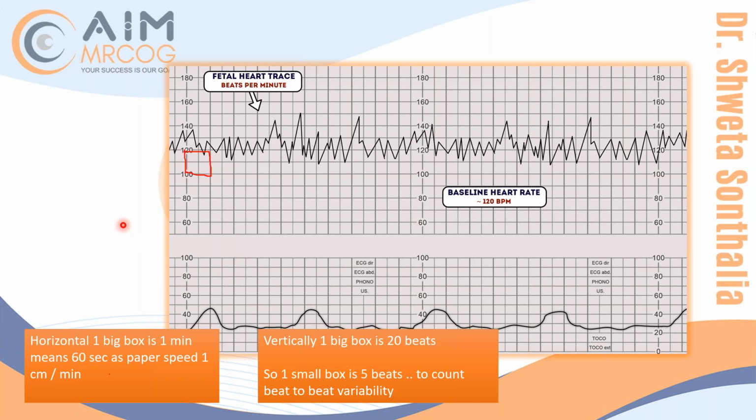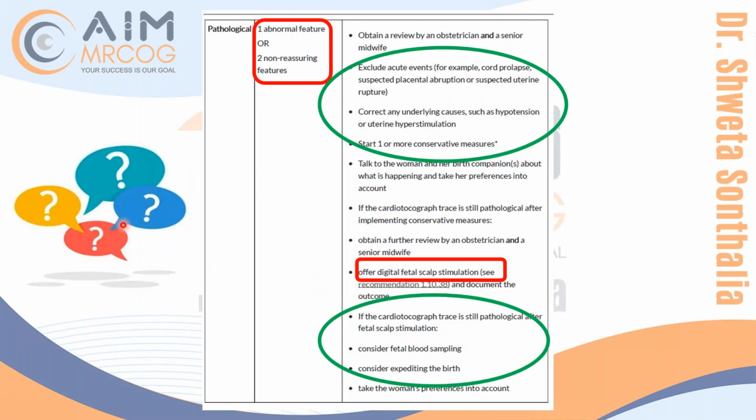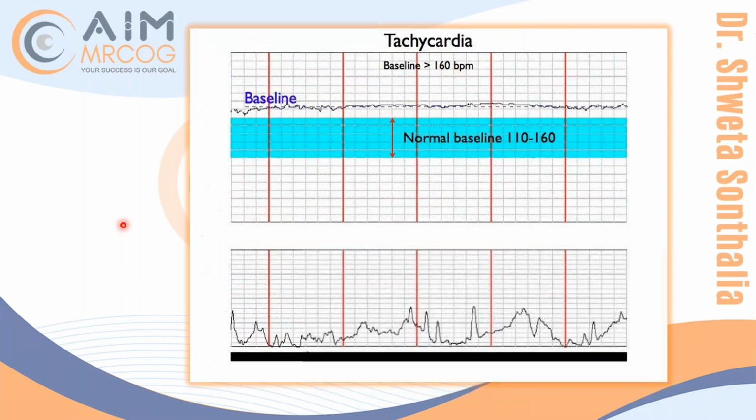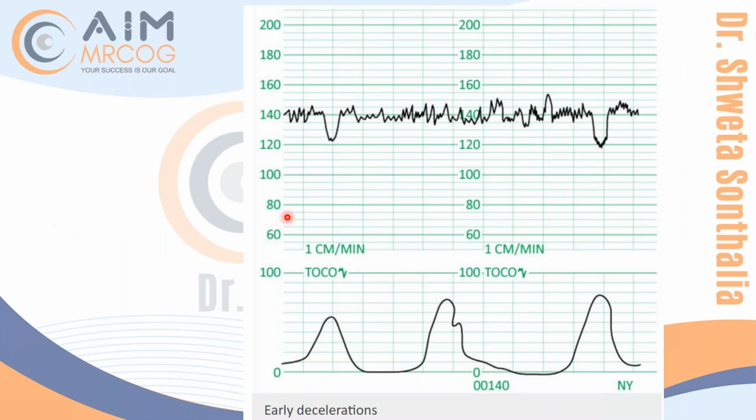Yeah, in this, there is no small box, Saranjeet. I'll show you in the next slide, just a minute. Because to understand it, I gave it like that. Wait. Like here, these are the small boxes. If you see here, the total is 20 beats, so this is 5, 10, 15, and 20. So this is how the CTG looks like: 5, 10, 15, and 20 beats. This is like the Toco probe. So here sometimes they keep the pressures.